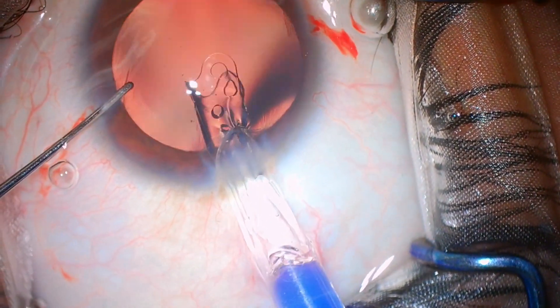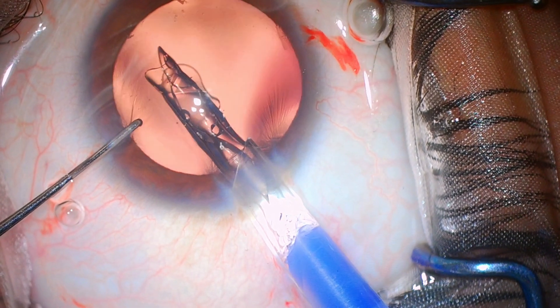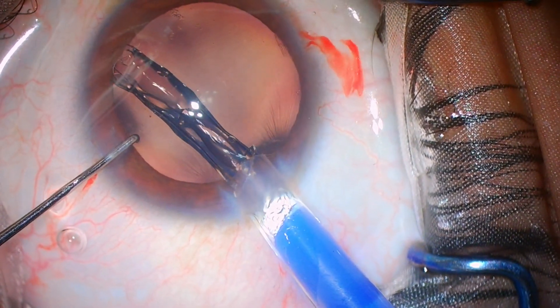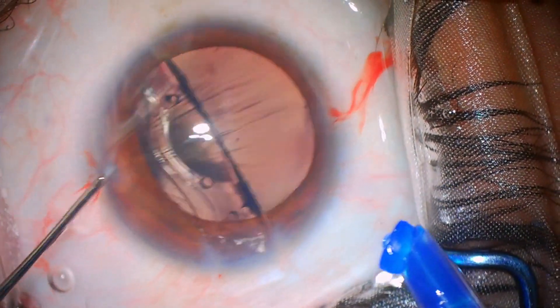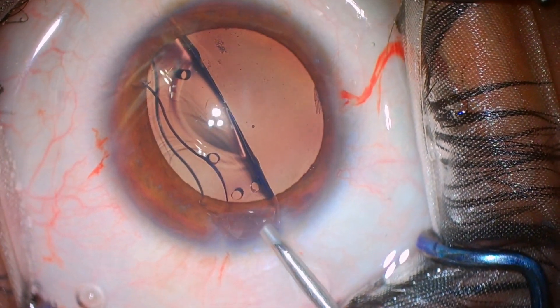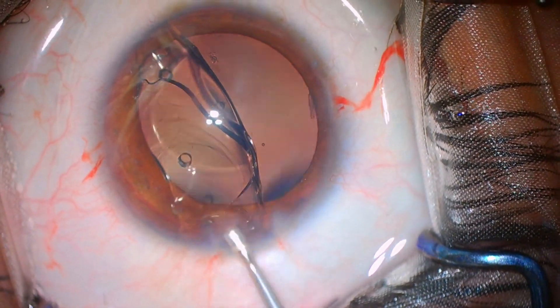Make sure that the nozzle is inside the incision. The mistake I made here was rotating the nozzle of the injector by mistake. What happened is that this IPCL, when it went in, got reversed as I pushed it inside the eye. You can see it looks like a tack, and when I pushed the trailing haptic inside it just opened upside down.